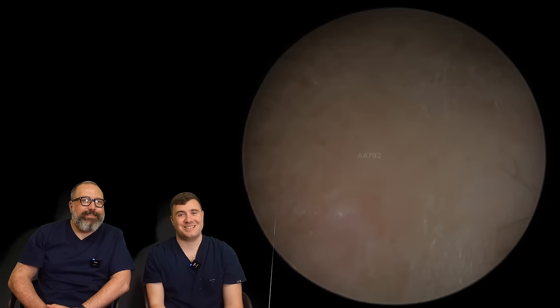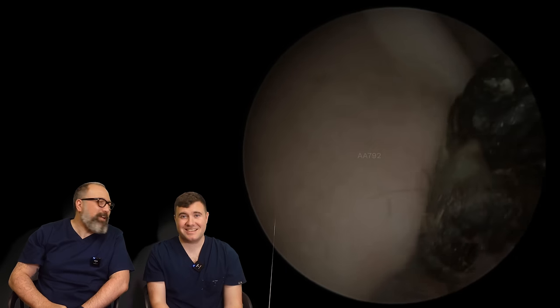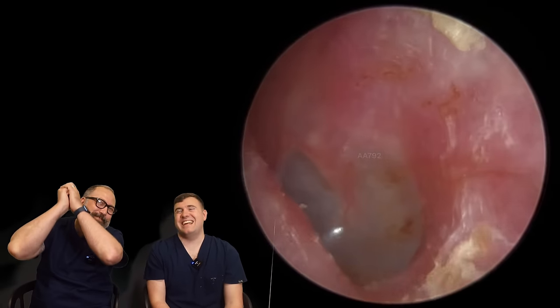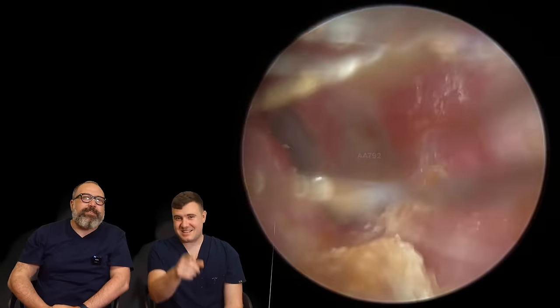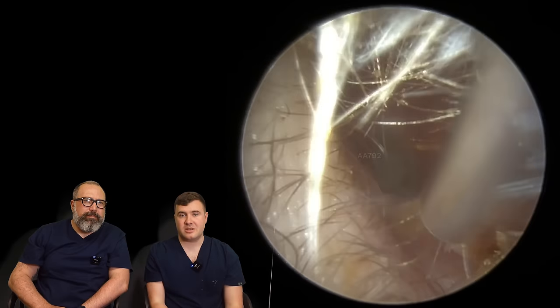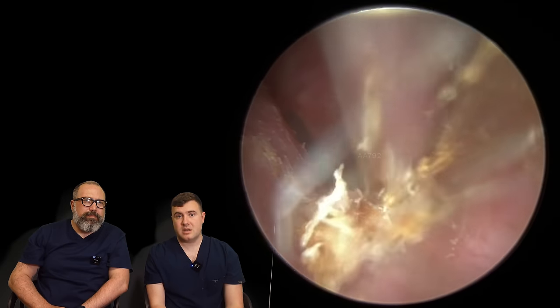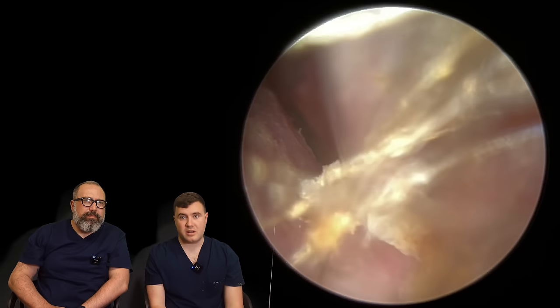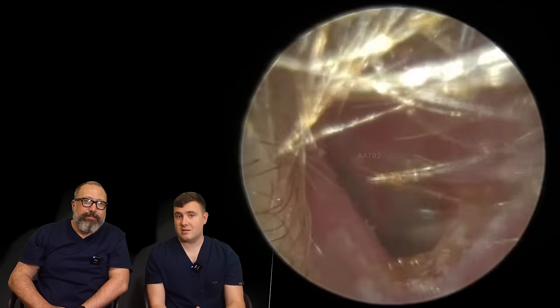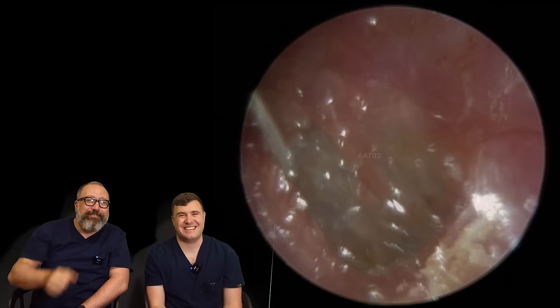I think we've got the same on the other side as well. What is that almost coal black colour? It's the weight of it probably — struggling to pick this up. Oh, you can see how dry that is. Look at how dry that canal is there. Little bits of this dead dry skin here now — we're just popping back in with a fine end, just to try and remove these last little bits. As you can imagine, the patient is already feeling so much more relief with that plug out. We should weigh the patient when they come in and weigh them when they leave and see the difference.